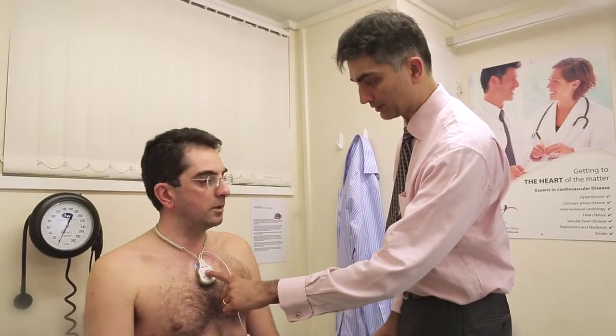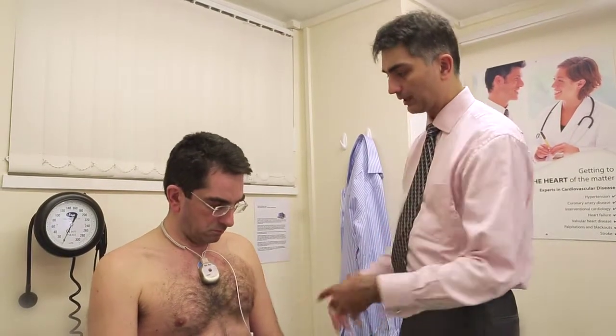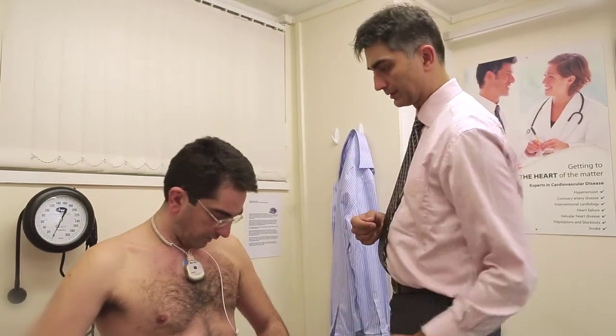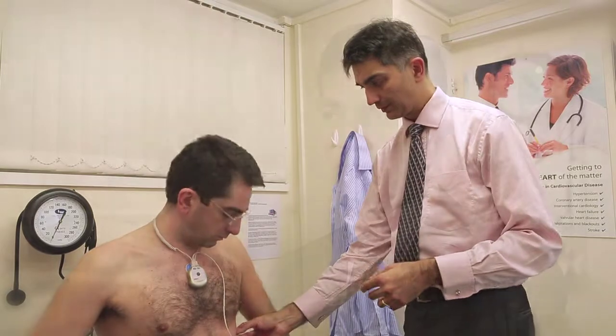The monitor is usually fitted in the clinic room. The electrodes are attached to the patient, usually two electrodes on the chest of the patient, and the workings of the monitor are explained. It's actually very straightforward. A monitor needs to be removed if the patient is having a bath or a shower, and can be reattached quite easily afterwards.